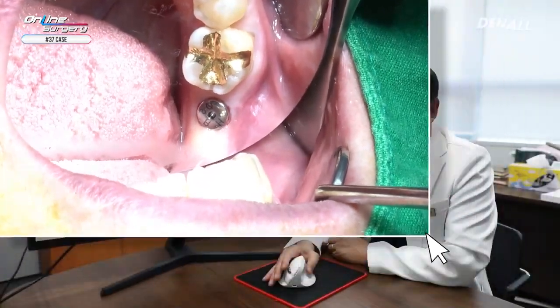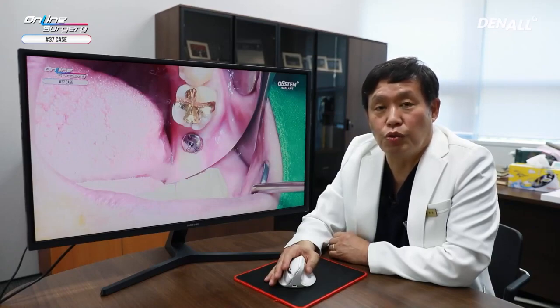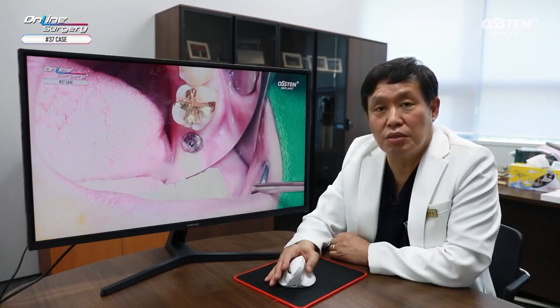Today's clip was simple, but to give you a tip or two, as shown earlier, when you do initial drilling, if it is not fully drilled up to the stop, this is because the contact with the bony tissue is not done properly. Therefore, you need to use flattening drill to remove the bone tissue on top to be able to drill initial drill fully. In the case of TS implant, there is tendency to place implants deeper.